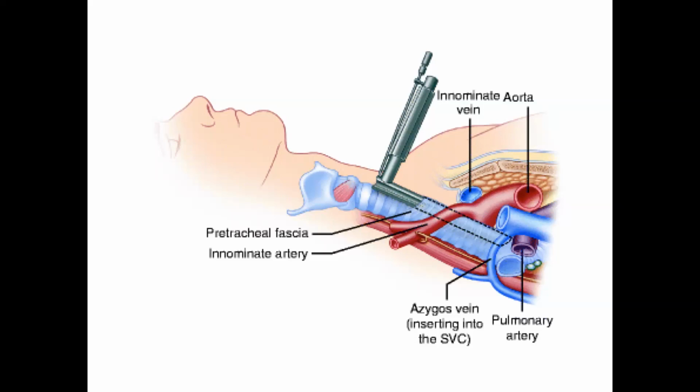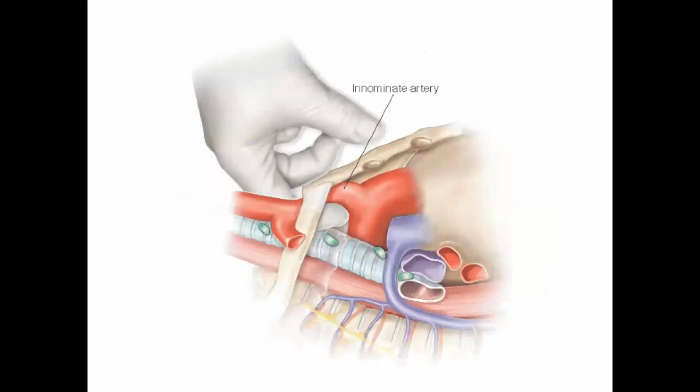And indeed, we need to look very closely at the mediastinoscope that we're using. We just changed some of our equipment. The newer ones are slightly bulkier, some of them with slightly sharper edges, and it's not impossible to cause problems to the trachea. For instance, if the scope doesn't run freely past it, then the traction, or the increased size, if we haven't made a big enough incision, could cause injury to the trachea and put traction on other structures.